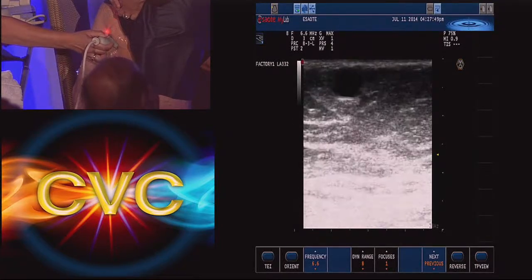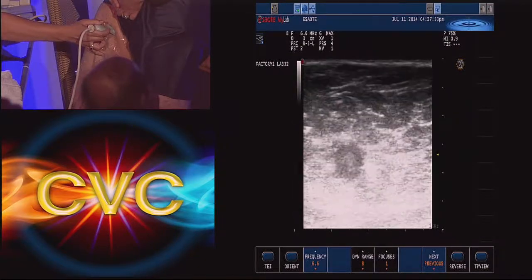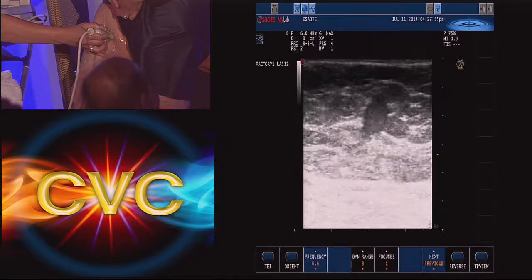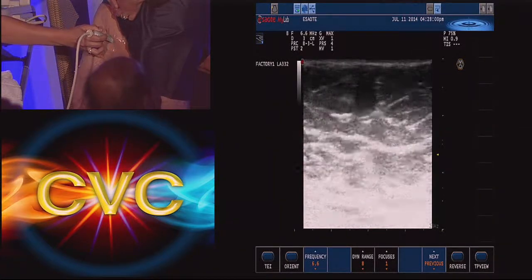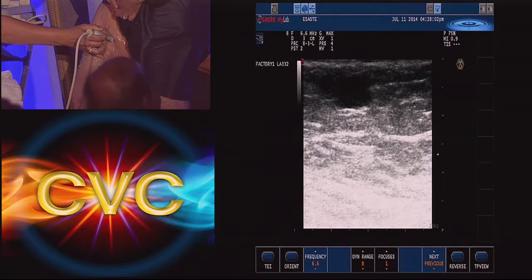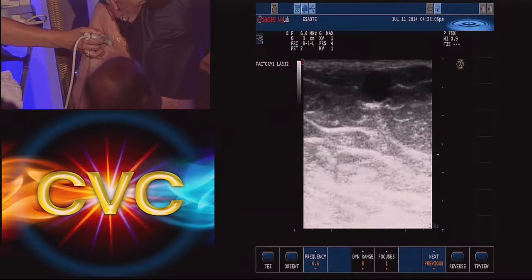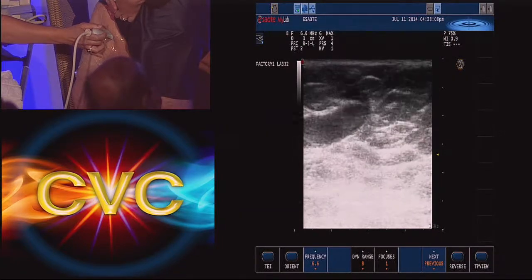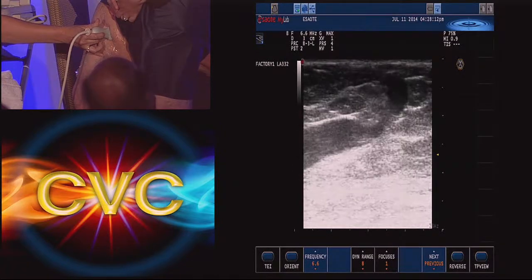And watch the probe here. And stop, go back. Right there. You see that? Now go back up the other way. When I say it, there, stop. So the branch there, it went out of the fascia. Did you see that? Where it went out of the fascia and goes in? So treating this, if you treated the saphenous right down at the knee, it would make a difference.